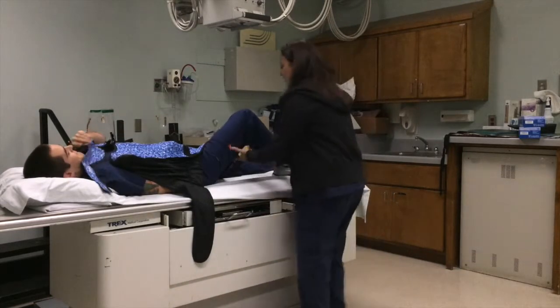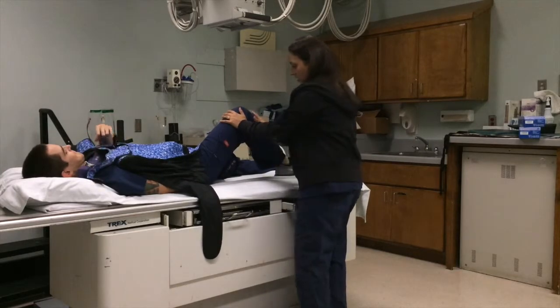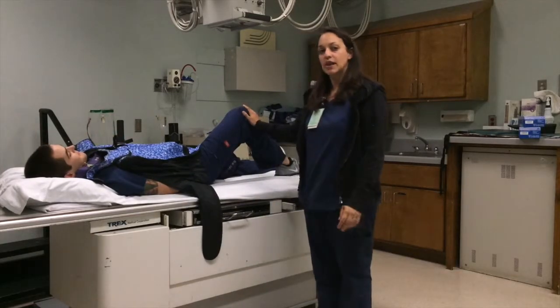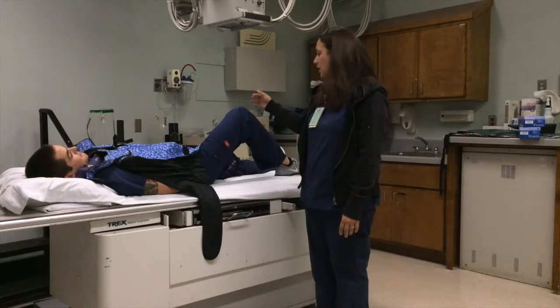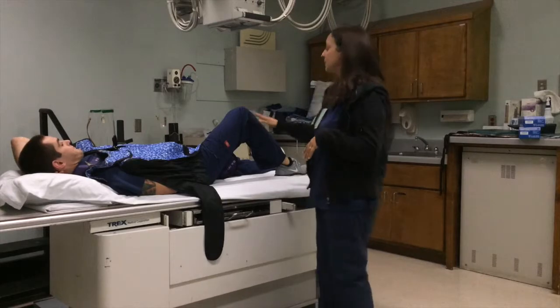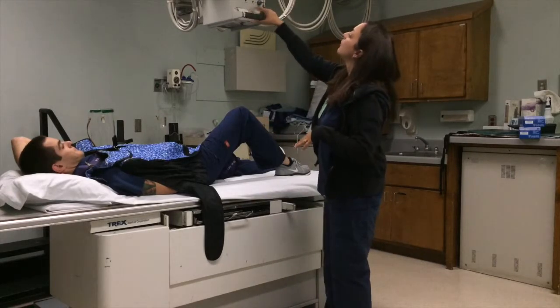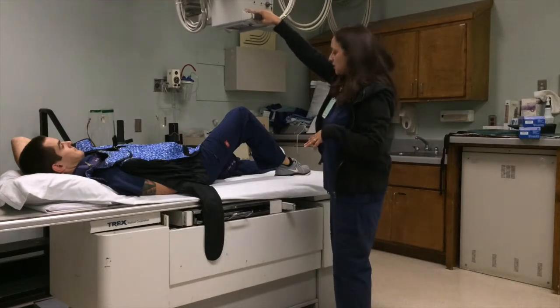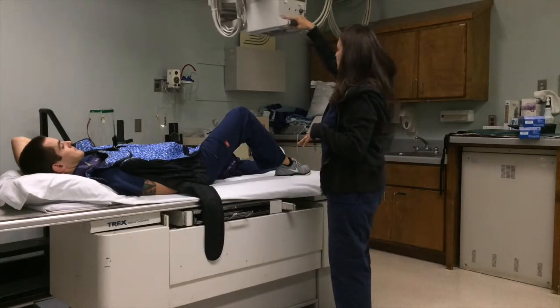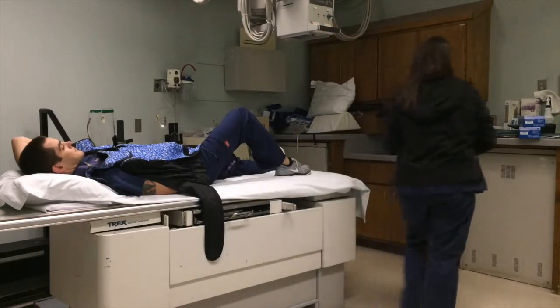Okay, so I'm going to have him bend his knee about 60 degrees. That looks great. For this first view, I'm going to do an AP axial view of the intercondylar fossa, which is also known as the Béclère method. So his leg is at a 60-degree angle. Now I'm going to move this down. Get that situated there.